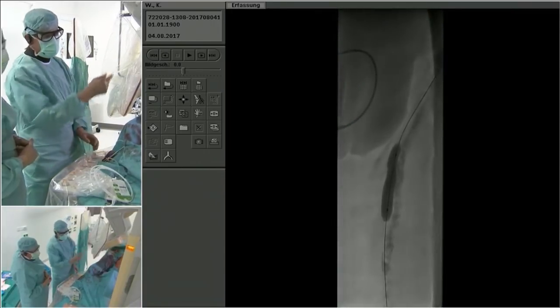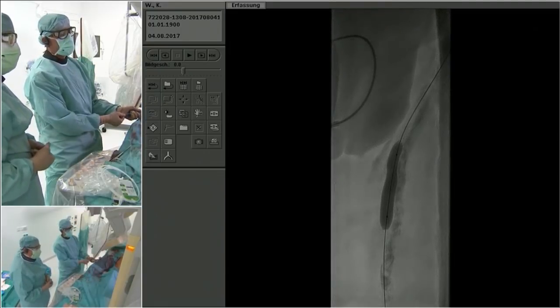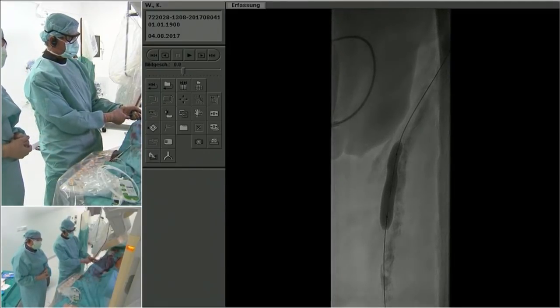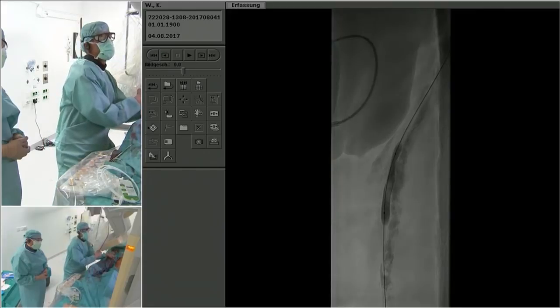So when you want to leave the lab, you're thinking of 5-year patency, not that I have flow, decent flow, and that it's going to be okay. So I think that's something to take into consideration, that you want to give this patient the longest patency possible.